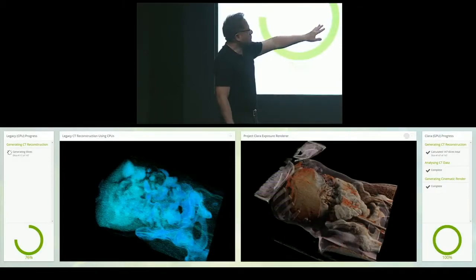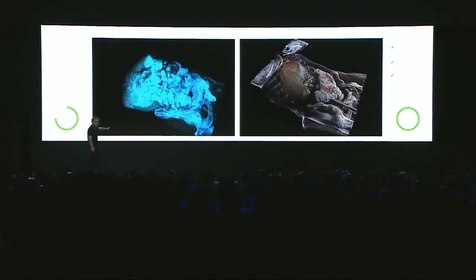The input for both of these sides, this is a traditional CT machine running filtered back projection. This is a traditional technique. It assumes that your body does not attenuate X-ray. But that's not true. The way that they solve this problem is simply to increase the dosage of X-ray so that your body does not attenuate the signal, and so that they could collect the back projection and reconstruct the image from it. This is a technology called iterative reconstruction.